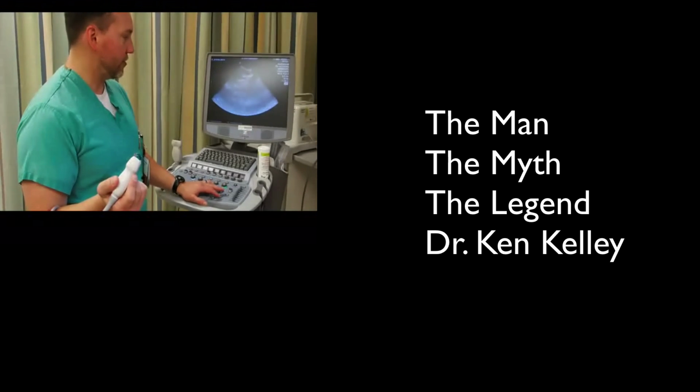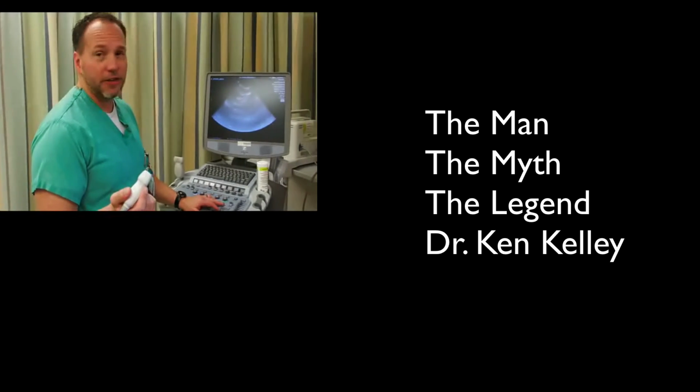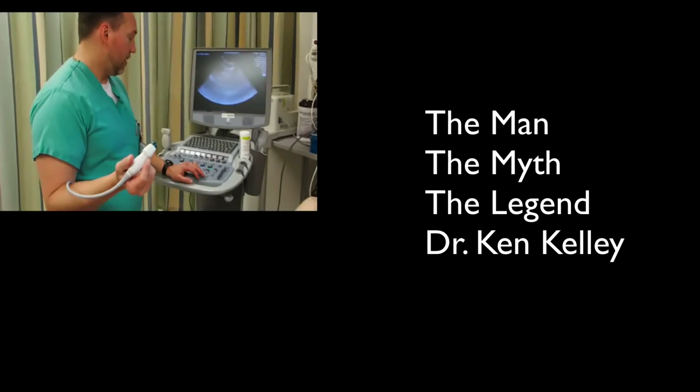Now I know that the anatomy and orientation can be confusing when watching a video like this, so now let's watch a real exam and review exactly how to do this. Like other exams, we're going to stand to the right of the patient. We're going to put our ultrasound machine to the right of the patient as well.